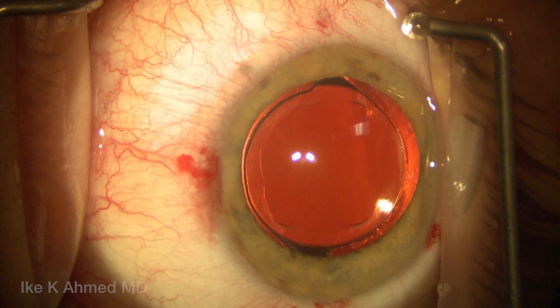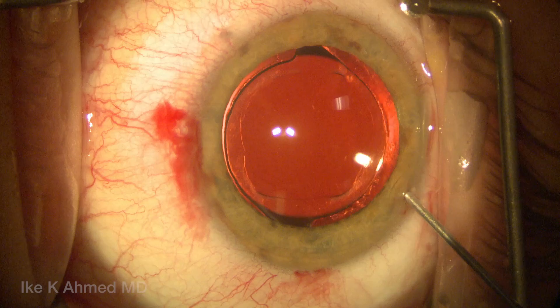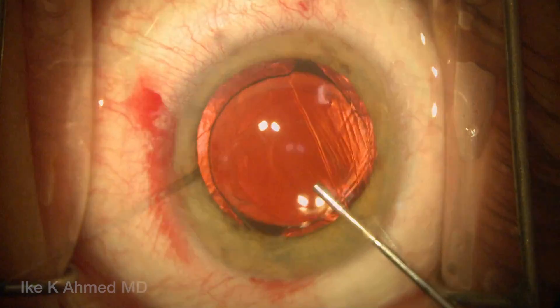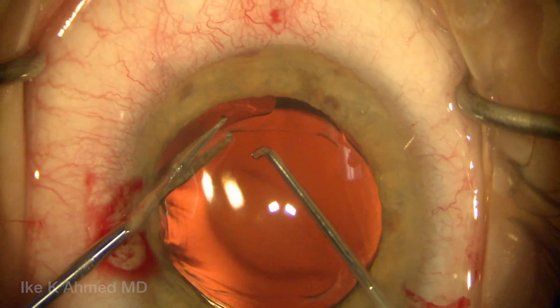This is a case of a patient with severe negative dysphotopsy with uneventful foldable acrylic lens placed in the bag. We see the lens is at the 3 and 9 o'clock position, sitting temporally with nice capsule overlap. We've injected some dispersive viscoelastic in the anterior chamber.